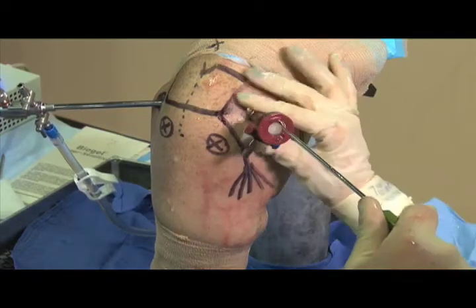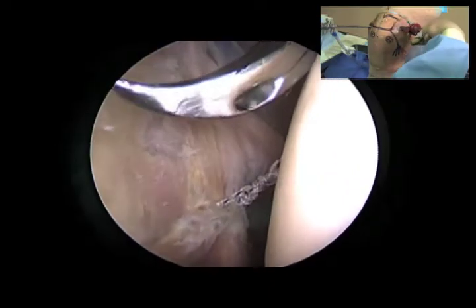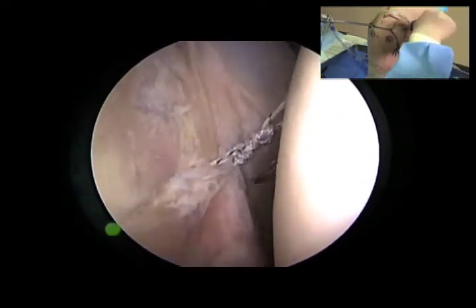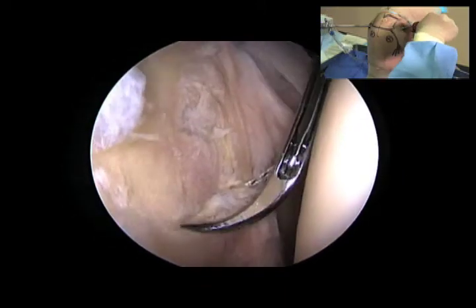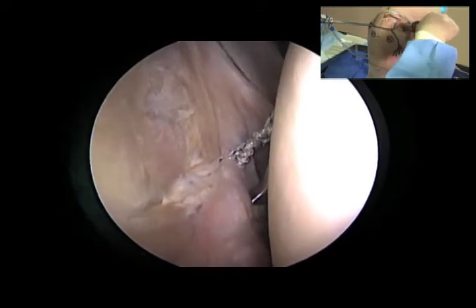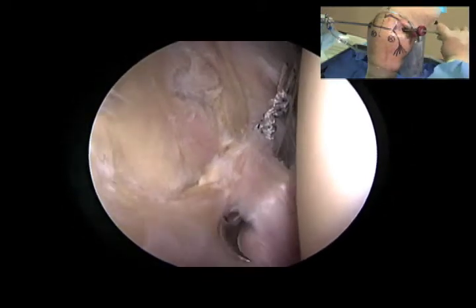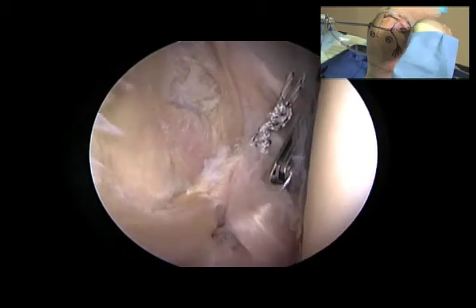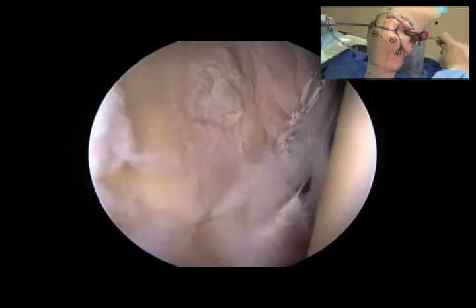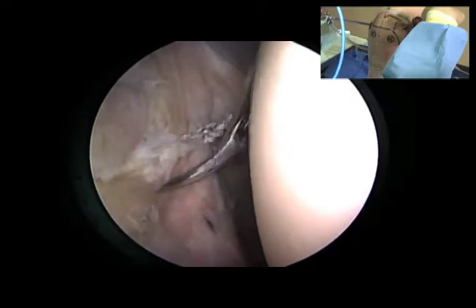In the same position, the sixer device can be utilized to not only suture the labrum, but also to suture the capsule. As we can see, the six o'clock point is where the tip of the device is. We can capture the inferior glenohumeral ligament with a small twist of our hand, pass this through the labrum at the six o'clock position, and actually pass beyond six o'clock with the sixer device.